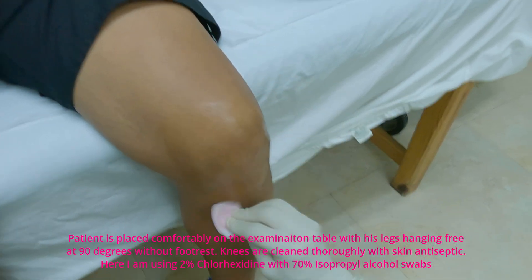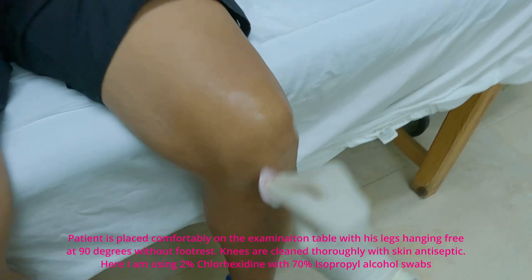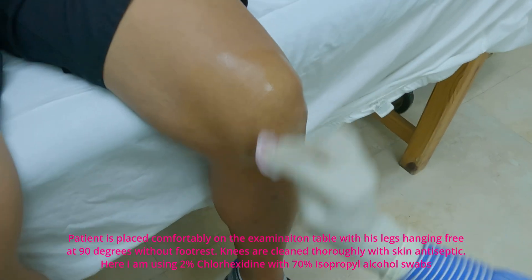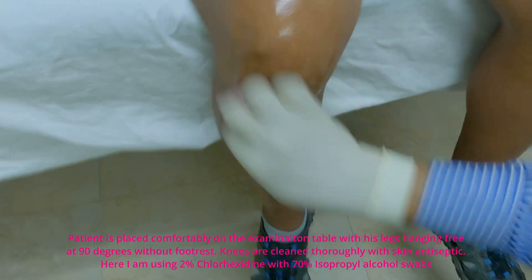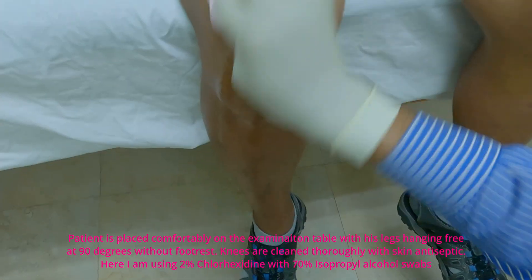The patient is placed comfortably on the exam table with his legs hanging free at 90 degrees without footrest. Knees are cleaned thoroughly with skin antiseptic — here I am using 2% chlorhexidine and chlorhexidine with 70% isopropyl alcohol swabs.